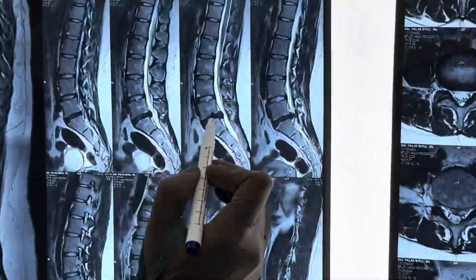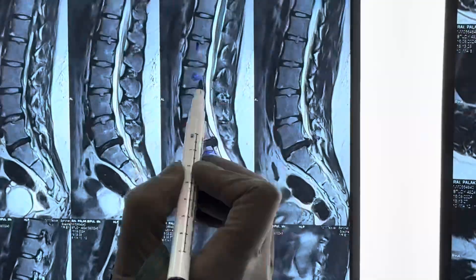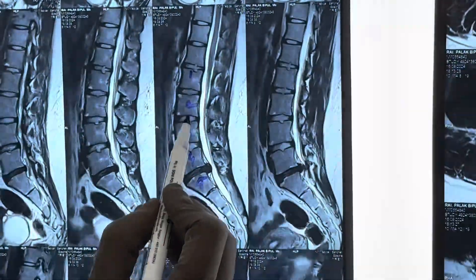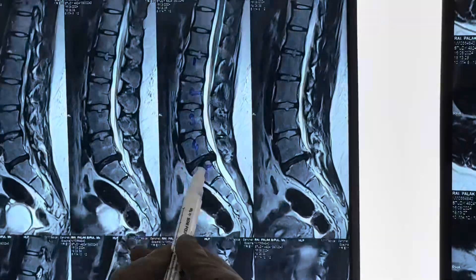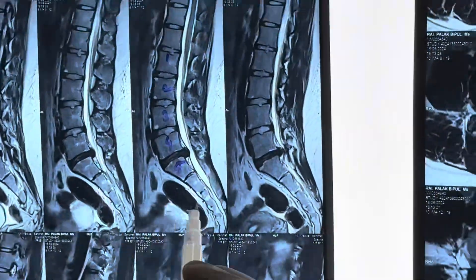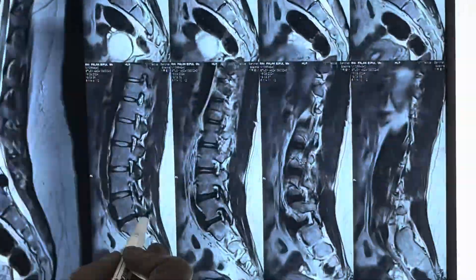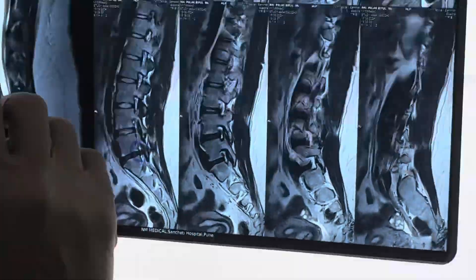Here you can see this is L5, L4, L3, L2 and L1. At higher levels the disc is very well hydrated, but here at L4-5 the disc has become totally black. This is the left parasagittal cut wherein we can see that the nerve is getting completely entrapped.